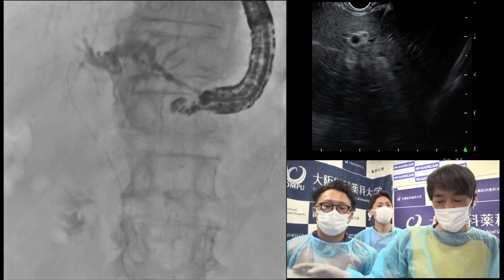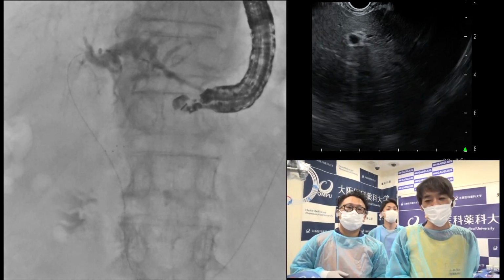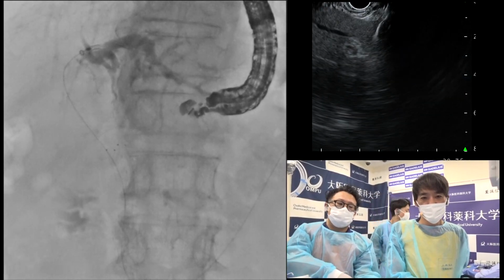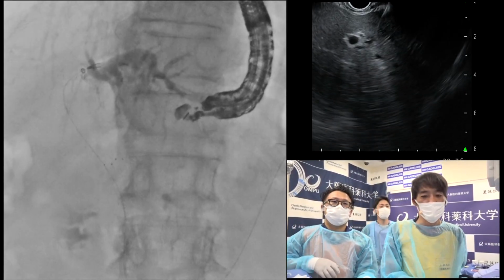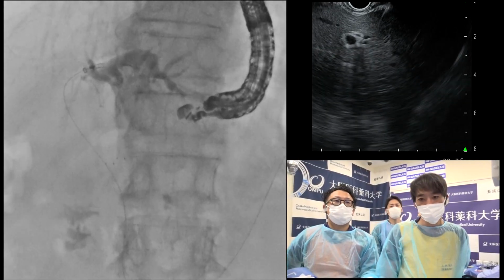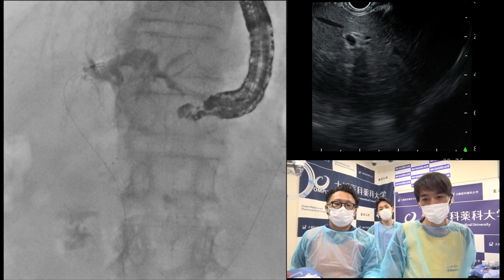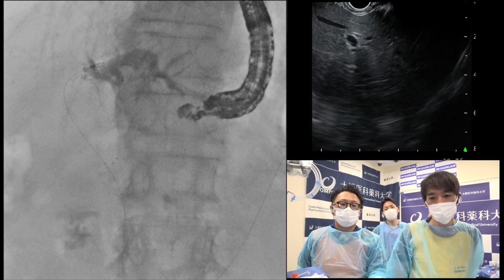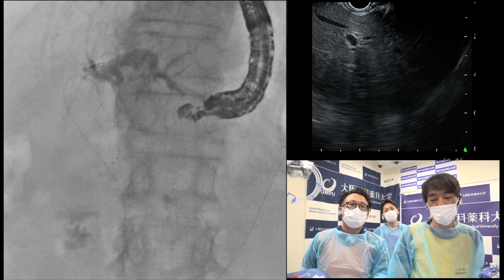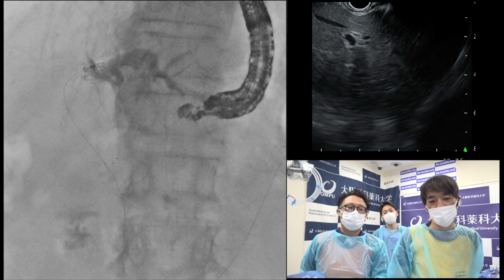We can all perform the EUS HGS, and we are experienced with over 100 HGS cases. So they are nurses? No, all doctors. So you train the doctors to help you, so then they will be able to do the procedure because they learn all the steps of the procedure, so it's going to be much easier for them to perform the procedure in the future. Correct? Yeah, right.